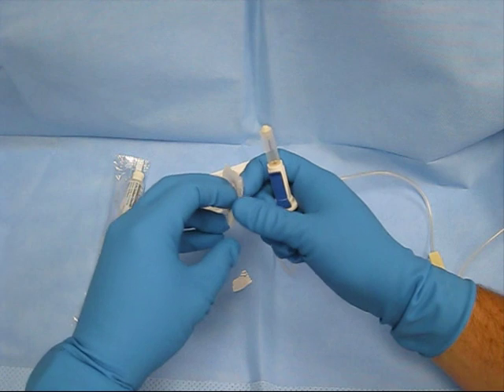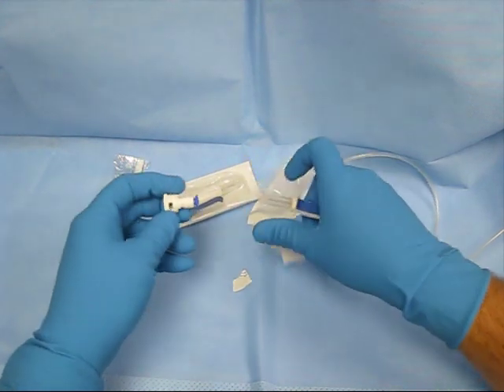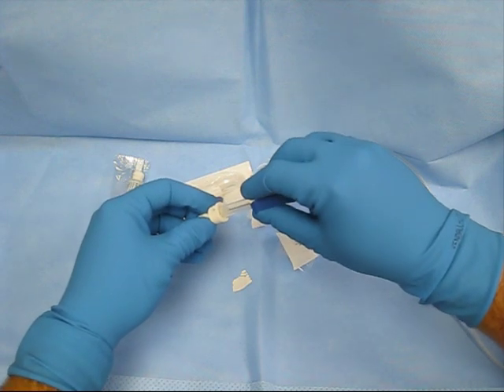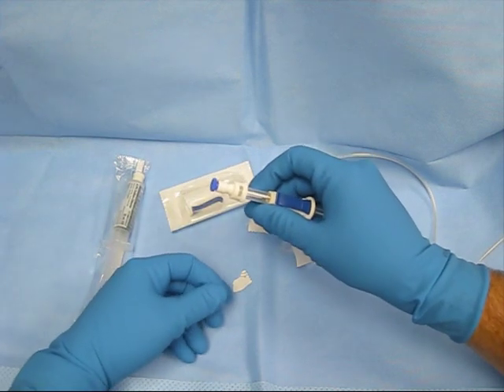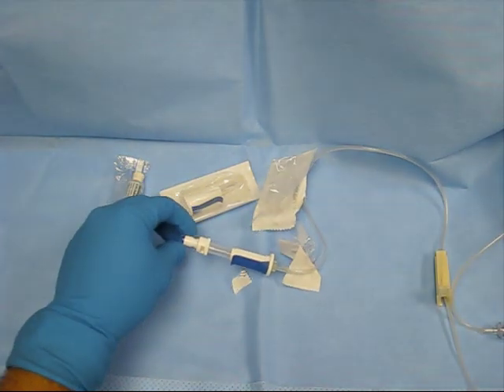Once it's primed, you can open up the connector. The connector fits into here like this — turn it clockwise until it clicks. This is now ready to be connected to the patient.